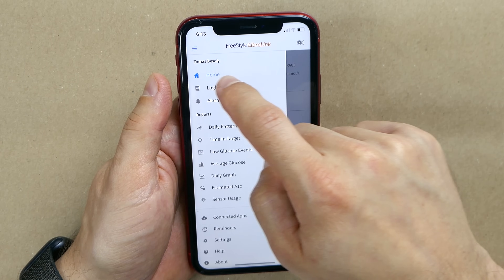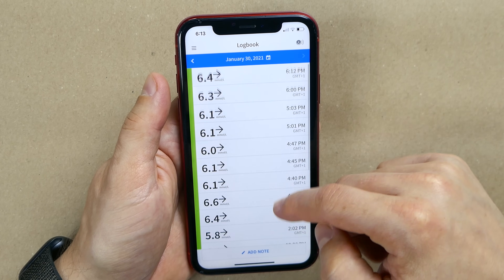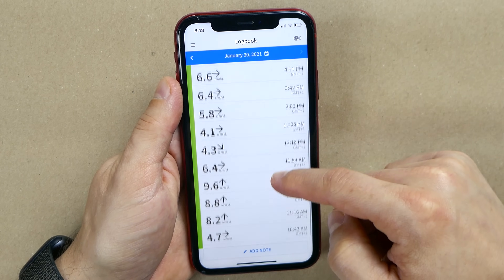Dark mode is not a game changer, but a nice feature to have if you don't want to wake up your partner or baby during the night with the white light. On the other hand, the older Freestyle Libre 2 app saves your blood glucose information in the logbook every time you scan. The Libre 3 app doesn't do that, but again, I don't think this is a deal breaker.